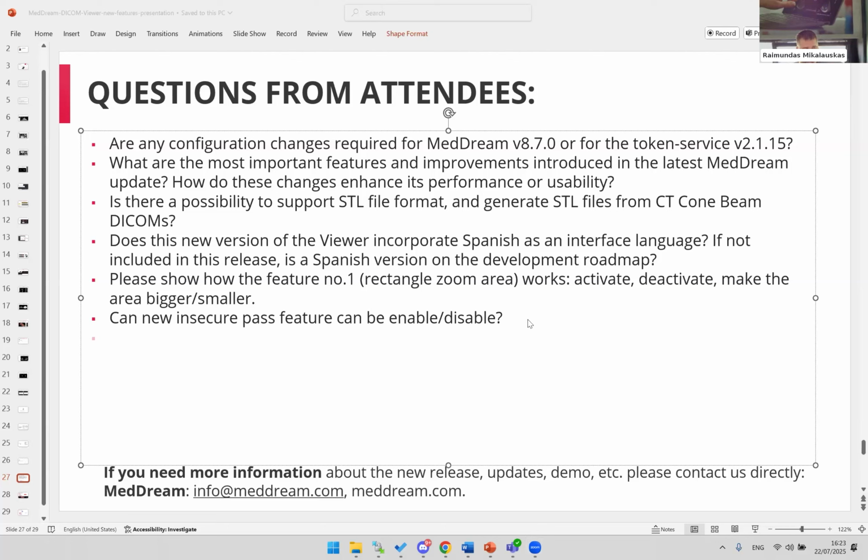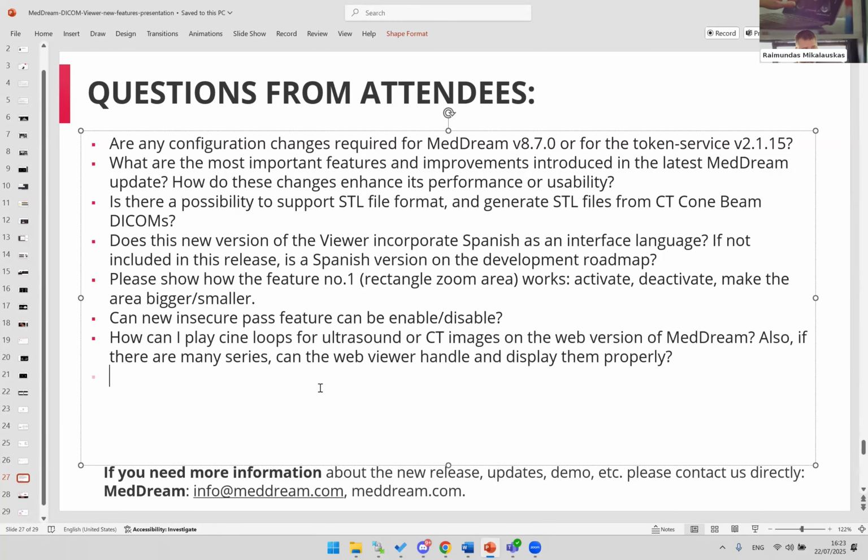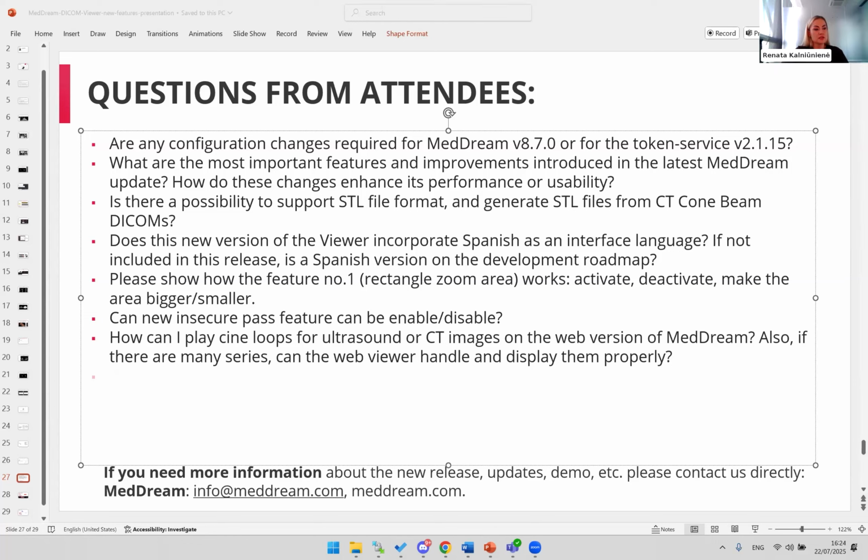In the later versions, in the future versions, we are planning to put all these 6 languages by default, and it will be part of development. Of course, with documentation, the user manual, we will translate it, but as we have to have it translated by a specialist of this language, it will take a couple of months, and the install manual will be in Spanish, French, or German. Okay, thank you. Next one.